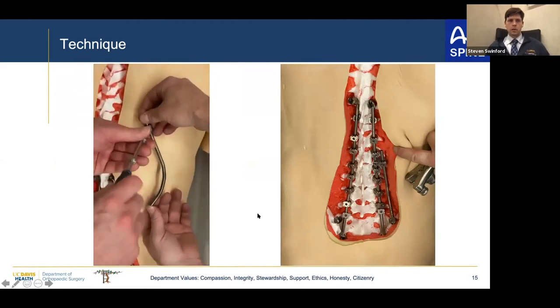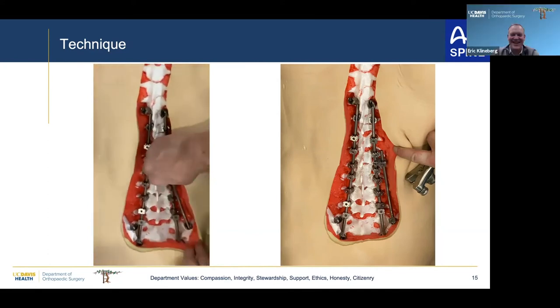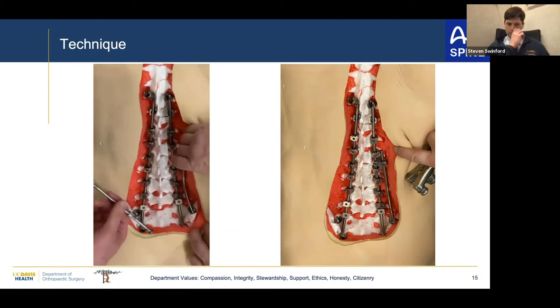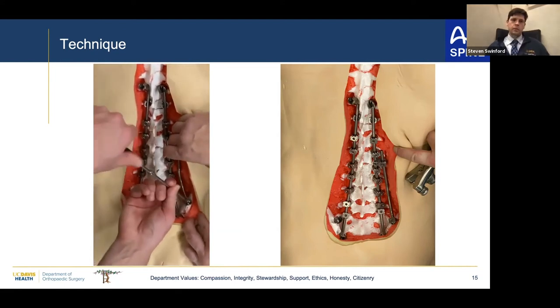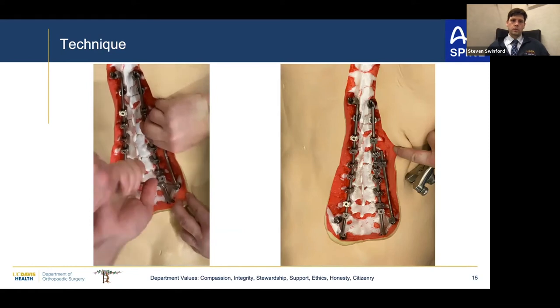Well, that's where you hulk out and make your assistant look weaker than he is. But you can get some better geometric stability by having an out-of-plane rod to help take off some of the stress from the primary one. And we also under-contour it because it reduces the amount of notch fatigue that it sees. So in theory, it should be more resistant to rod fracture.